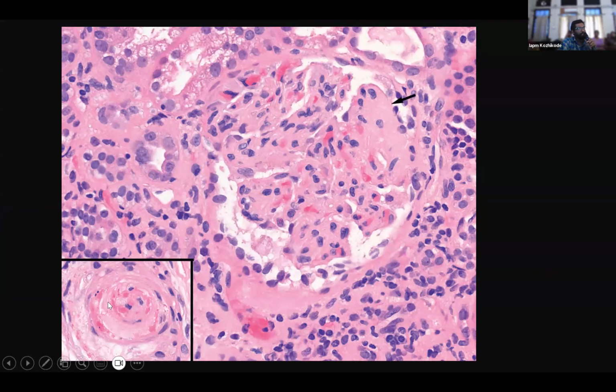A primary thrombotic microangiopathy, most commonly due to some dysfunction in the C3 complement metabolism. So you can see almost the same kind of picture, onion skinning and the thrombus, and even in the glomeruli you can see the microthrombus and broken RBCs, and this is what is called a pseudo MPGN pattern. Pseudo MPGN pattern in the thrombotic microangiopathy.